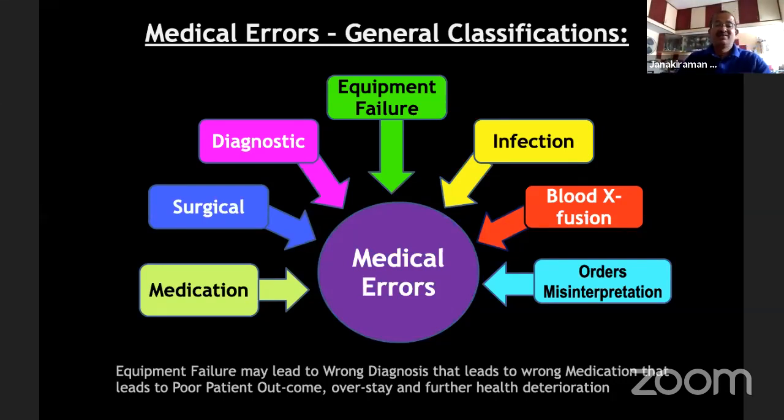All lab, I'll give you a small example. 5 ml of your blood is sent to 5 different labs to check your bilirubin. And I don't think all the 5 labs will give the same results. If they give the same results within the tolerance, it is accepted. But all the 5 labs will give almost the same results if the lab equipments are tested and calibrated for accuracy. I understand you will believe this.